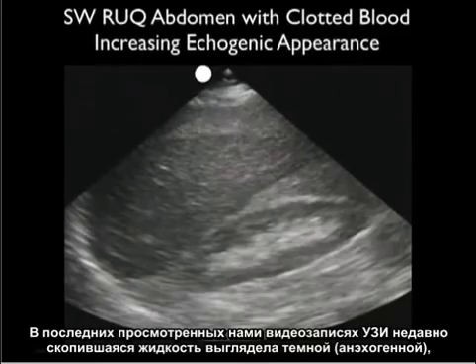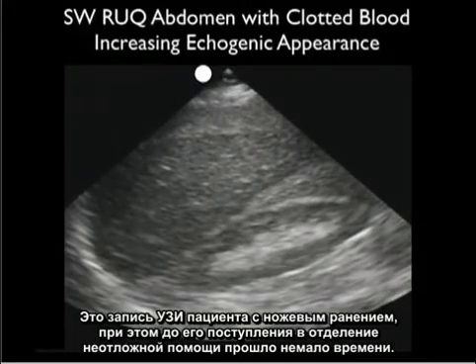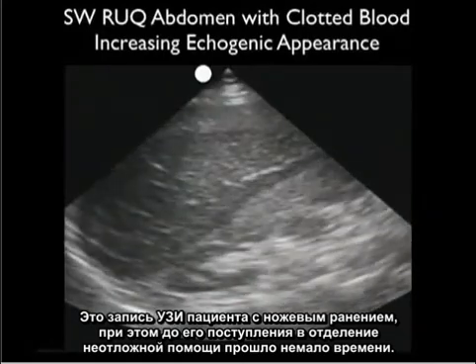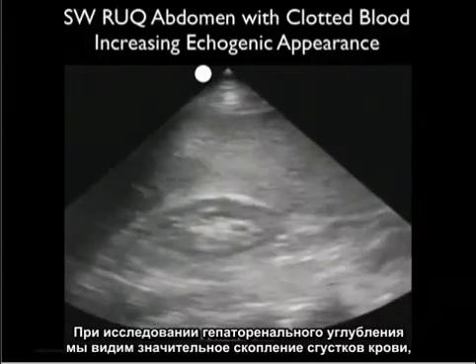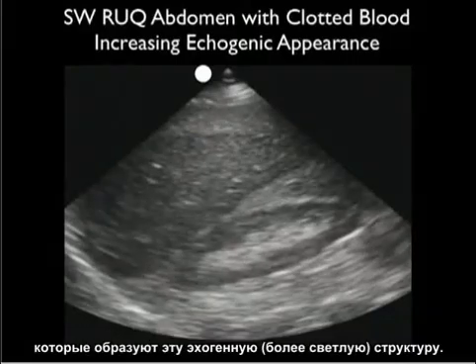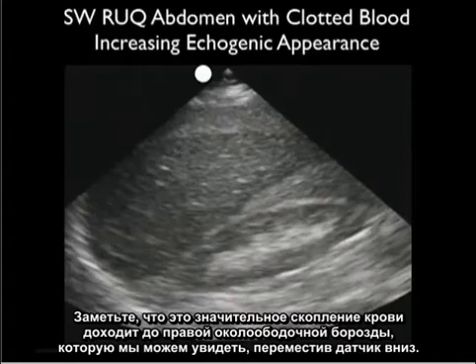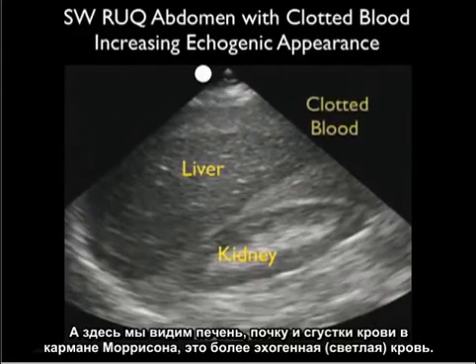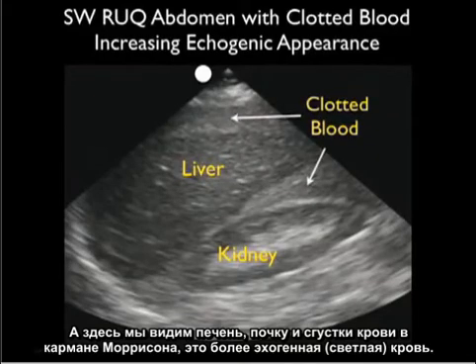In the last few video clips the appearance of fresh fluid on bedside sonography was dark or anechoic. However, as blood clots it can take on a more echogenic or lighter appearance. In this video clip, a patient was stabbed and had a significant downtime before being brought to the emergency department. As we look at the hepatorenal interface, we see a large amount of clotted blood made up by that echogenic or lighter appearance. The large amount of blood extends into the right pericolic gutter as we scan inferiorly, and here we can see the liver, the kidney, and the clotted blood — that more echogenic or lighter blood — in Morrison's pouch.